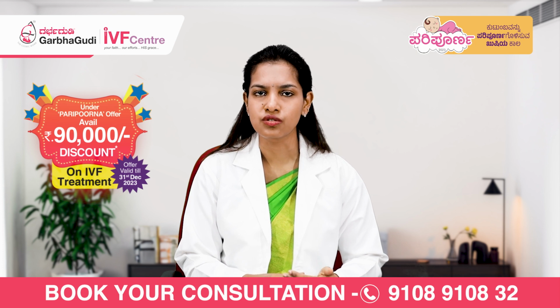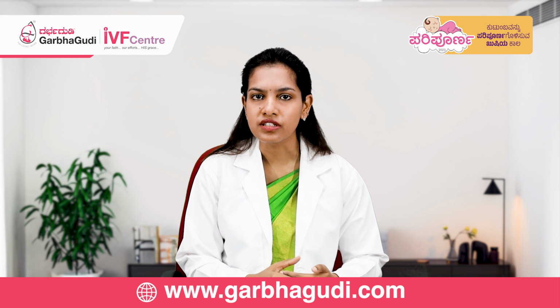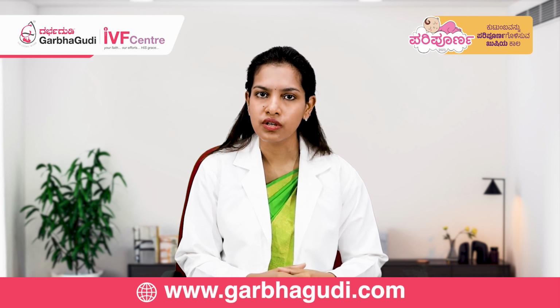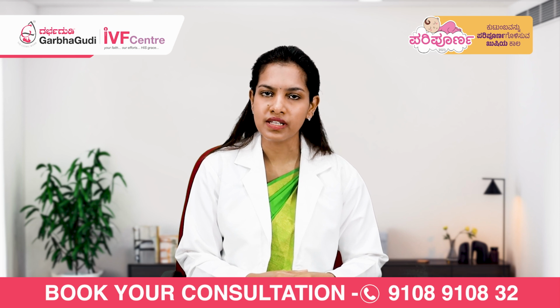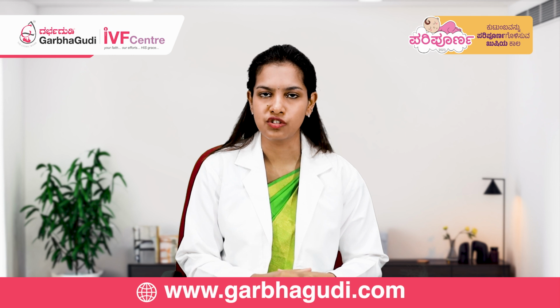Another indication of hysteroscopy is when we come across couples who've had repeated implantation failures, meaning they've had embryos transferred to their uterus before, but for some reason they've failed to conceive with those embryos. In these cases, a hysteroscopy will give us additional information and help us decide the further course of management.